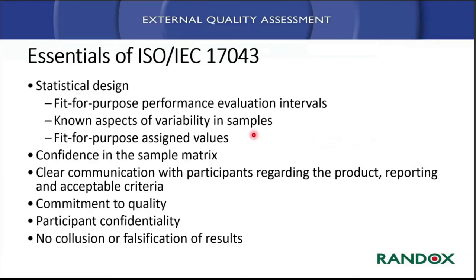You're looking at the samples, you're looking at the matrix, you're looking at communication with the actual end users. There's a commitment to quality. There is a commitment to participant confidentiality. And importantly, you need to look at there shouldn't be any collusion or falsification of results.